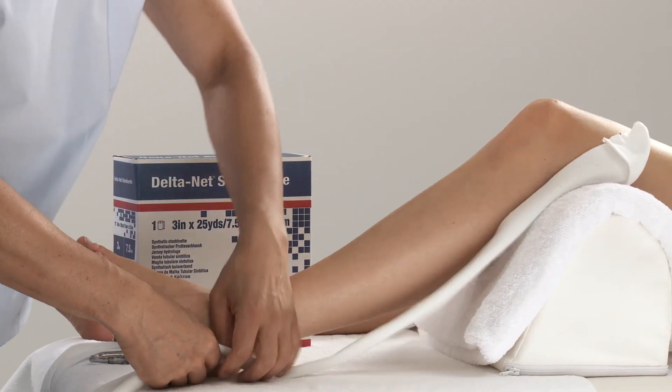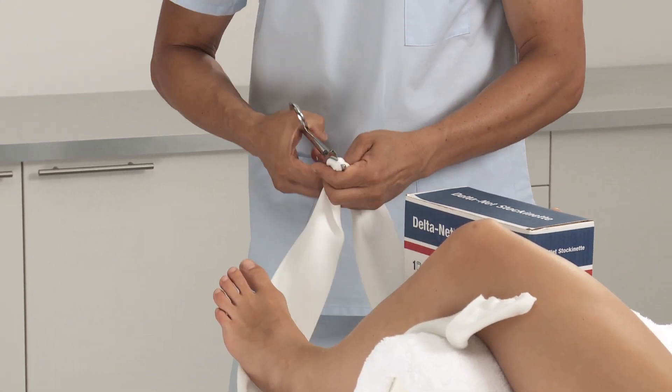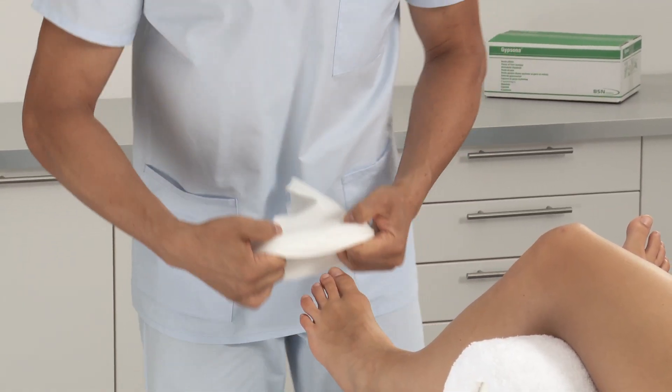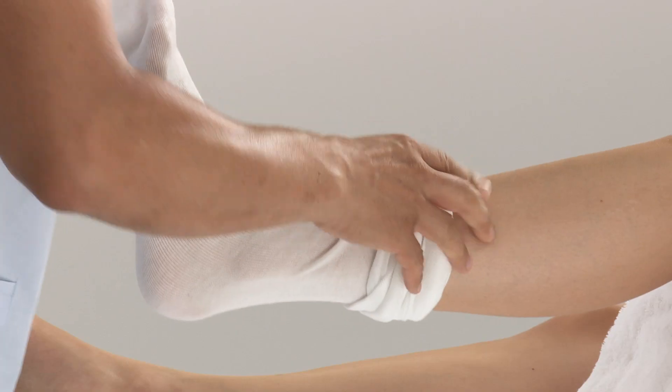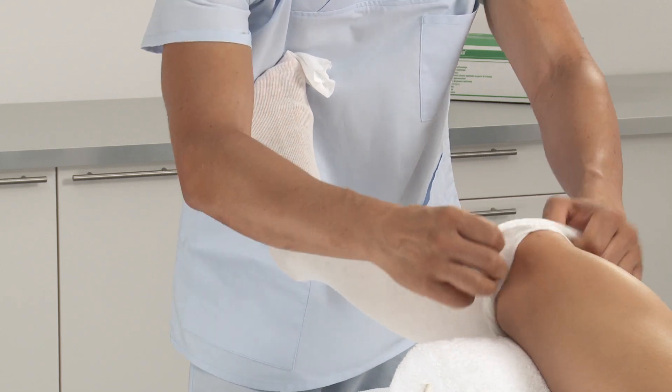Choose the appropriate width of stockinette. Measure the length from knee to toes, add double the foot length, and cut. Roll up the stockinette before applying onto the limb to overcome sliding pressure during application. Roll off over the leg and remove all wrinkles and creases.